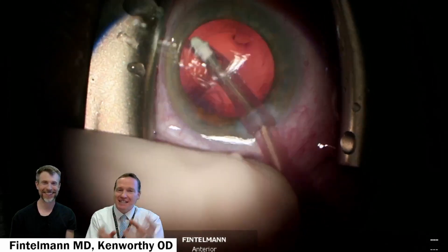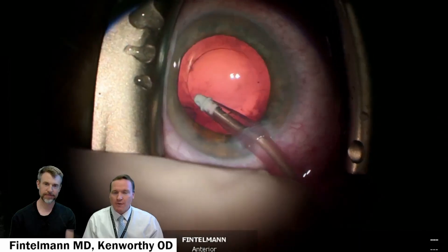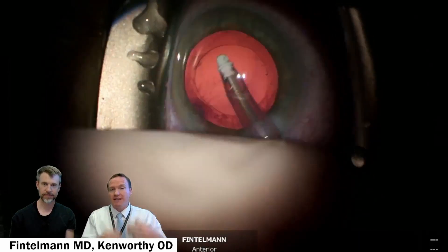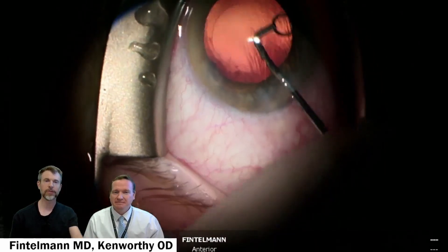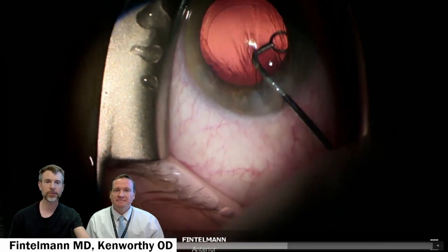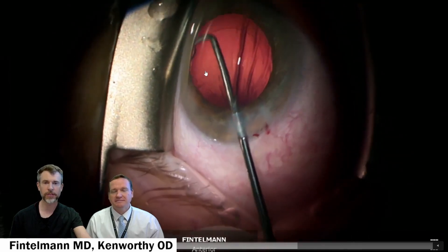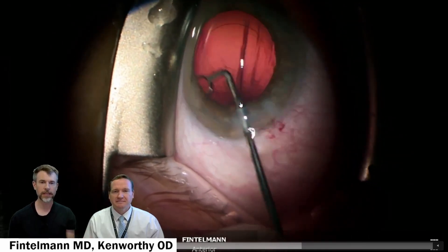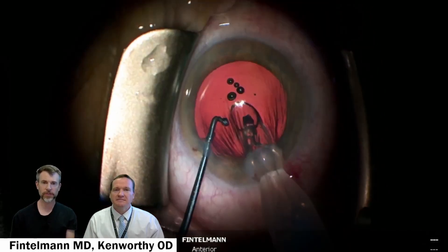With these fine vibrations, you're seeing the rest of that cataract coming out, and polishing the inside of the capsule, getting it ready for where the new lens is going to be placed and provide the patient with good vision. Here, polishing the posterior capsule — you see some folds forming — and then another curette to remove as much of the opacity as possible before the new lens goes in on both sides. Then more viscoelastic is placed to create space for the new lens.